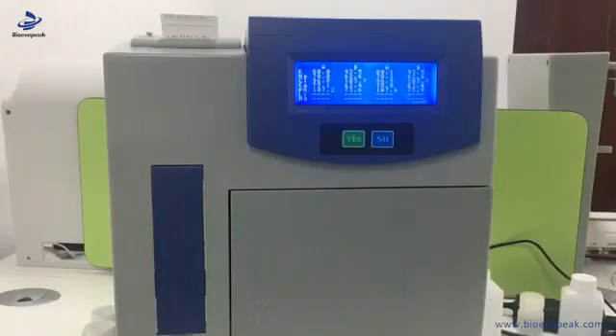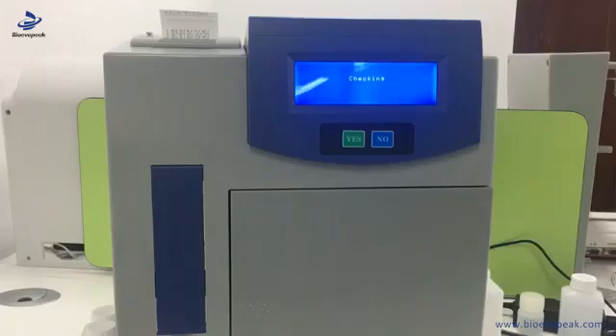It will display A1, B1, A2, B2. It will take one more minute to finish, and it will go through self-checking and self-washing. It will take a while to finish the calibration procedure. Now it will show the result of solution A and print out the calibration result on paper.